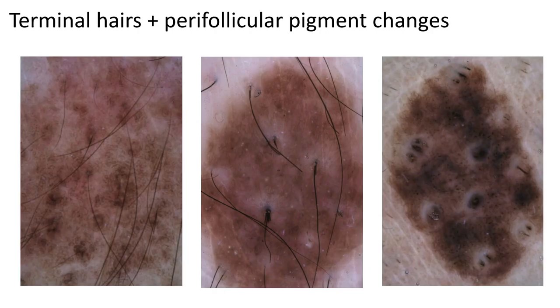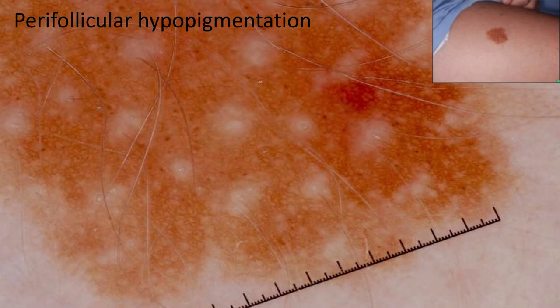Finally, terminal hairs and perifollicular pigment changes. We see thickened, darker hairs present in congenital nevi, and perifolliculally we can see pigment changes — that can be hyperpigmentation, hypopigmentation, or a combination of both. Another example shows thickened, darker terminal hairs and perifollicular hypopigmentation.